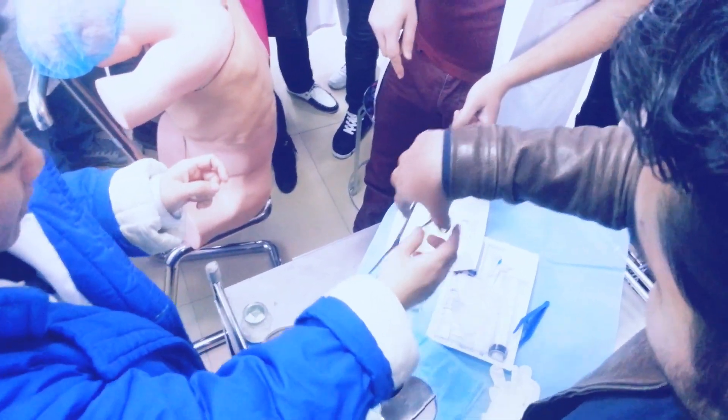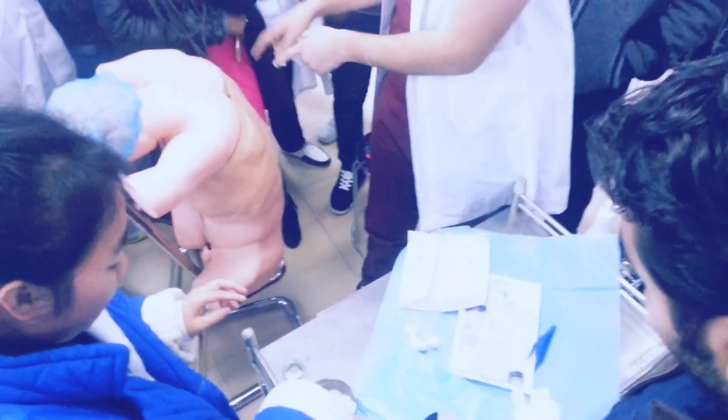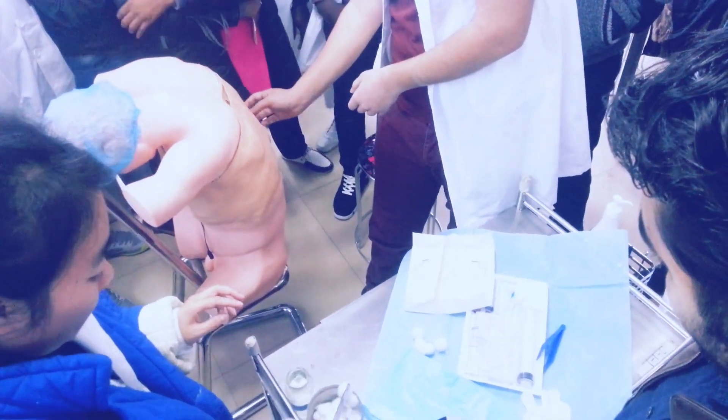I think maybe I can do this. And I forgot one thing — before wearing gloves, I will disinfect the area which I have marked here.